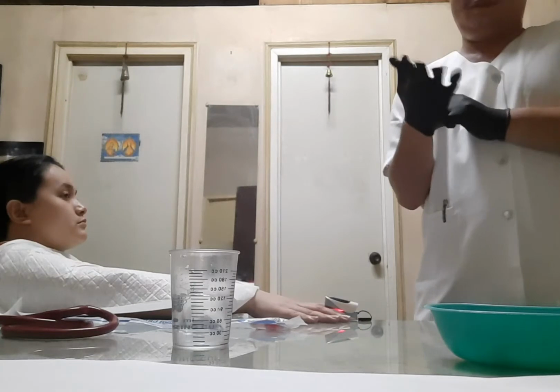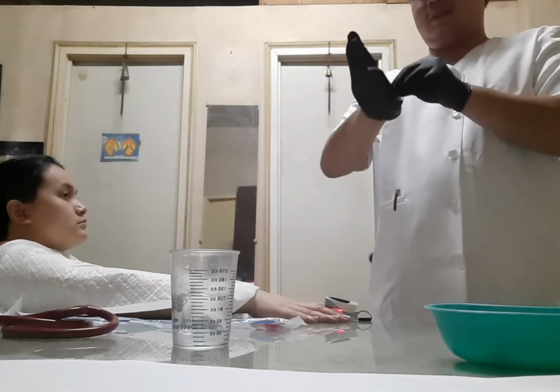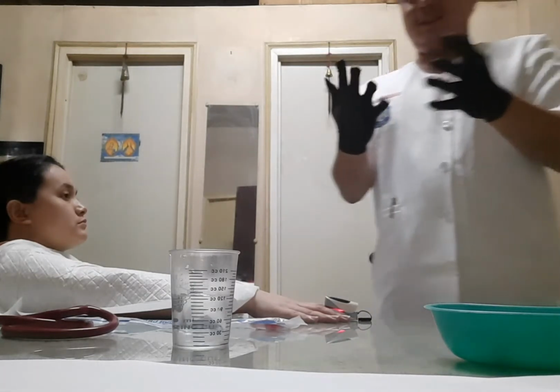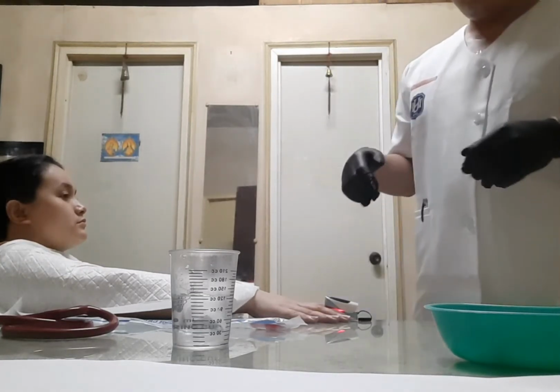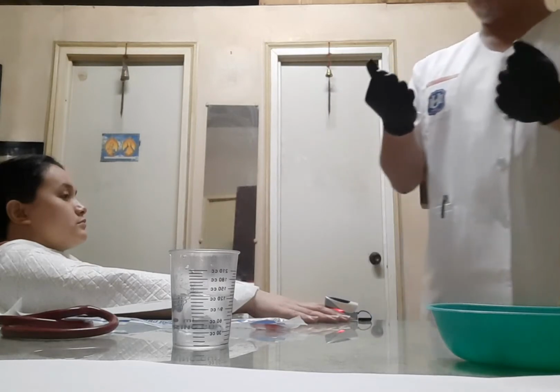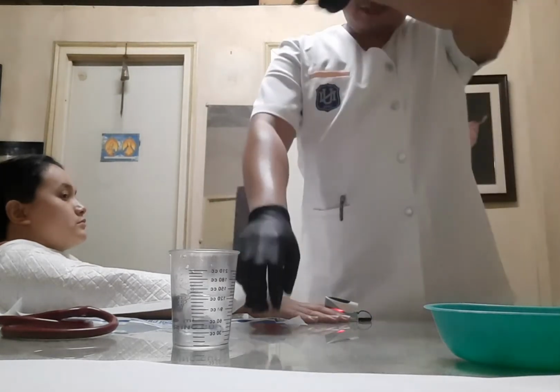Gloves. Now after doing my gloving, I will open the suction catheter.